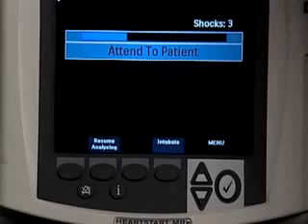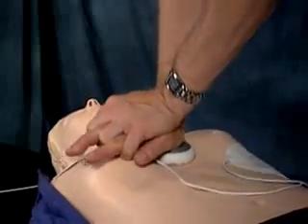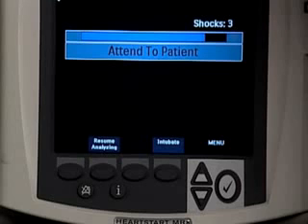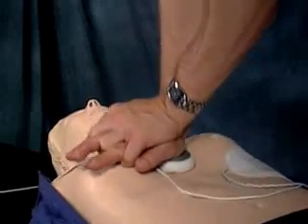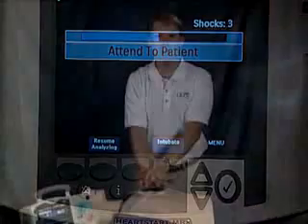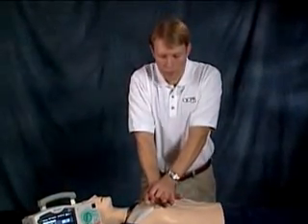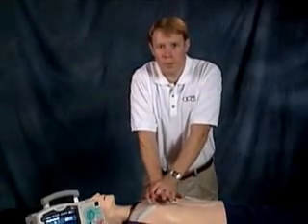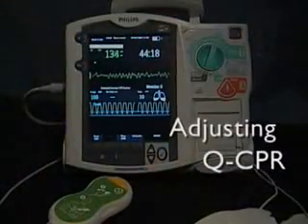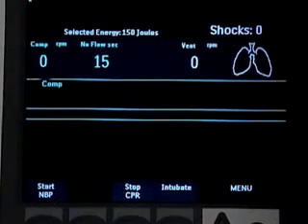Now I'm not going fast enough. Compress a little faster. At this point, my compressions are not deep enough. Compress a little deeper. Now I'm going too deep. Don't compress quite so deep. If I haven't done a compression for 15 seconds, it will prompt me to start again. 15 seconds without compressions.